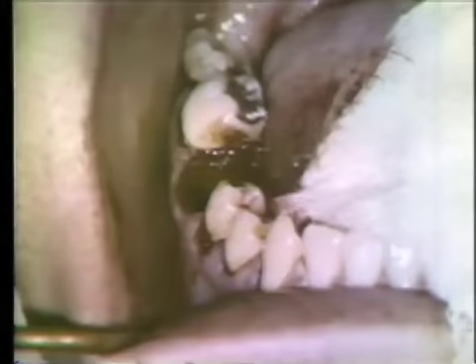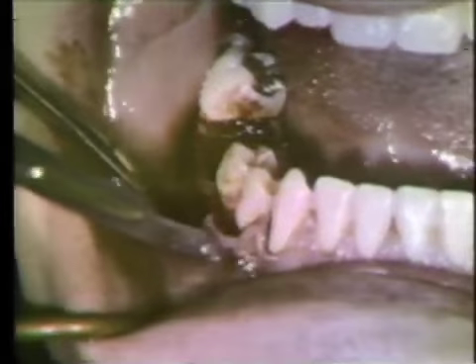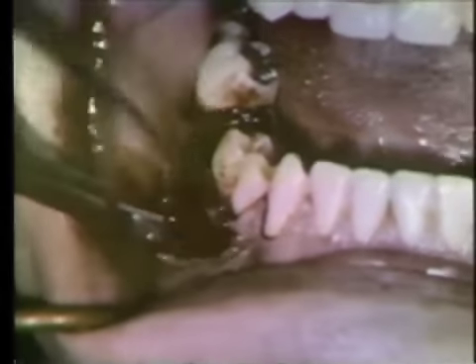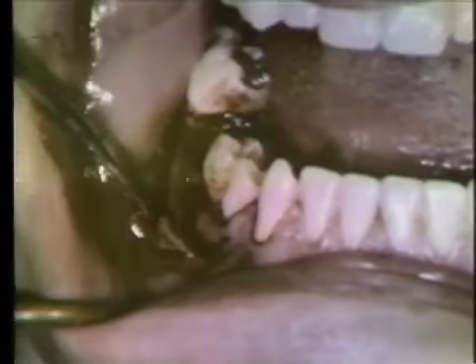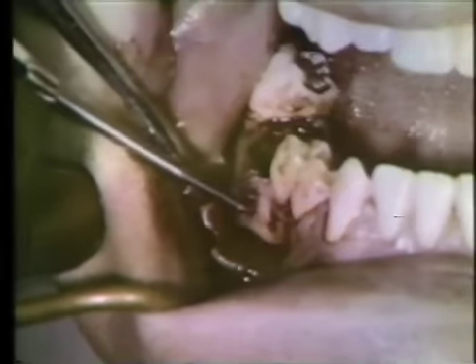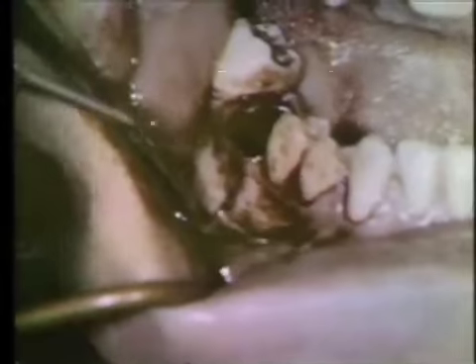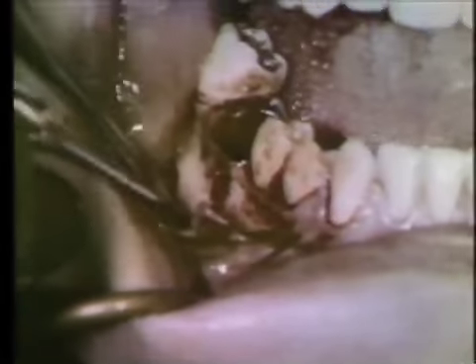You will notice that the title suggested that this operation necessitates a tooth in the posterior segment in order to control that segment. This operation can lead to difficulties if there is not sufficient dental control of the posterior segment of the mandible. With the flap then reflected, the periosteum is retracted downward. The bone drills are cutting through the cortical plate and into the socket area.